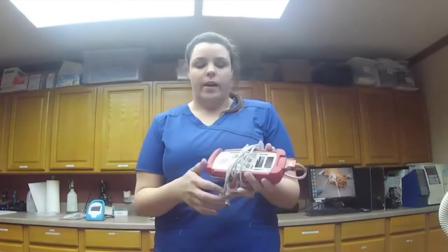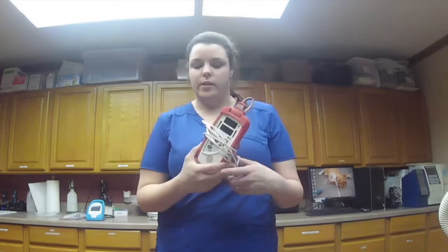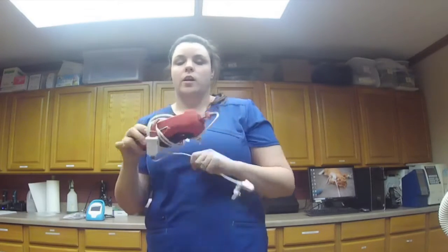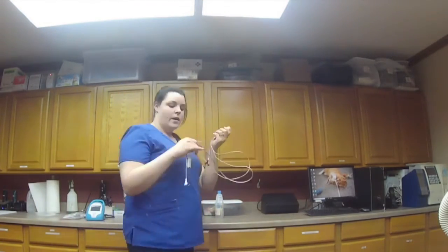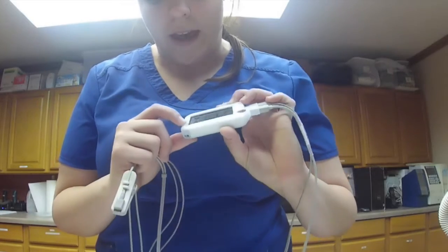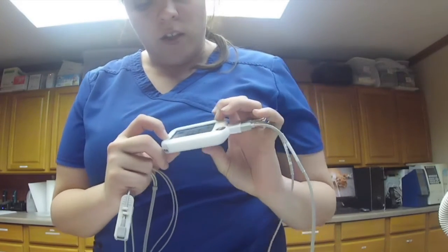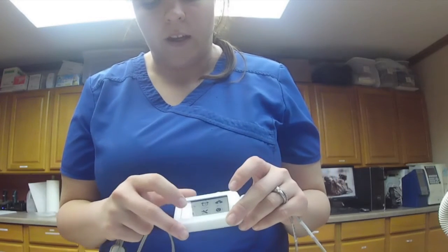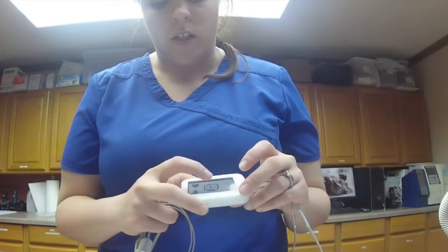Check a pulse oximeter. We have an older school one, but we don't use it as often. All you do is hook this piece to part of the flesh, so either the dog's ear or the dog's tongue. You'll turn it on and it will monitor through surgery. What we actually use a lot is a newer version of this. It has an ECG recorder. It has your pulse oximeter and your thermometer, and you can do a daily check. And then it has how you can review everything that you just saw.